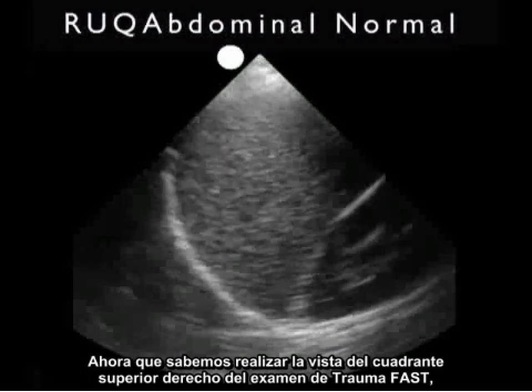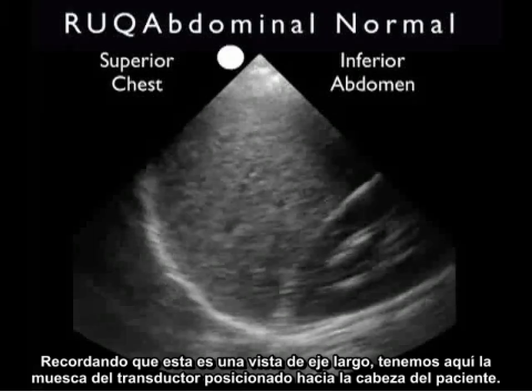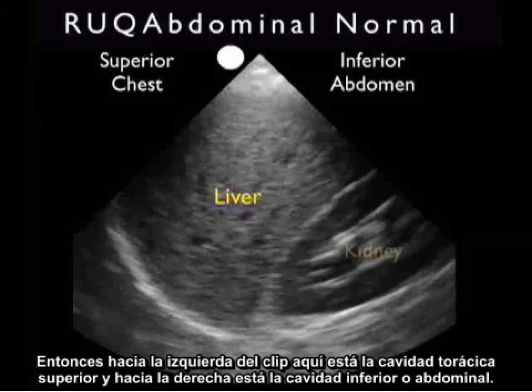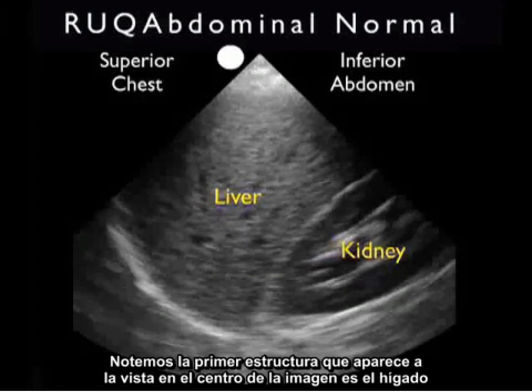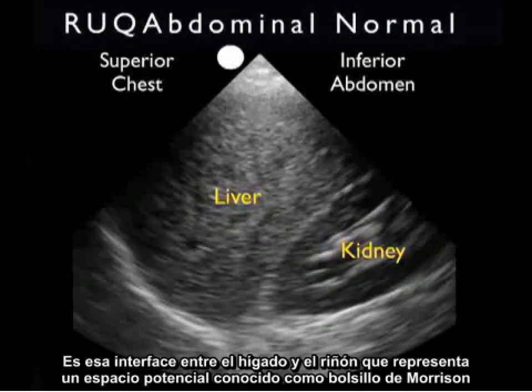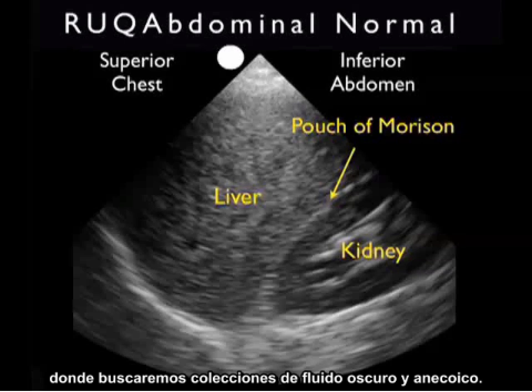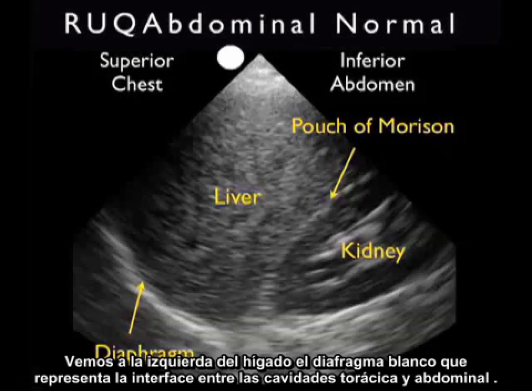Now let's take a look at a normal image you might obtain. Remembering that this is a long axis view, the probe marker is positioned towards the patient's head, so towards the left of the clip is superior or chest cavity, and towards the right is inferior or abdominal cavity. Notice the first large structure in the middle of the image is the liver, and inferior to the liver we see the football-shaped kidney. That interface between the liver and kidney represents a potential space known as Morrison's pouch, where we look for dark, anechoic fluid collections. We see a thin white line making up a normal exam, representing the fat within the capsule around the kidney. To the left of the liver, we see the white diaphragm representing the interface between the chest and abdominal cavities.